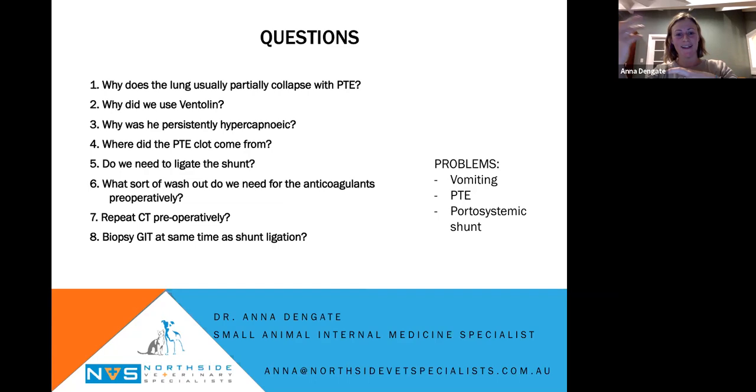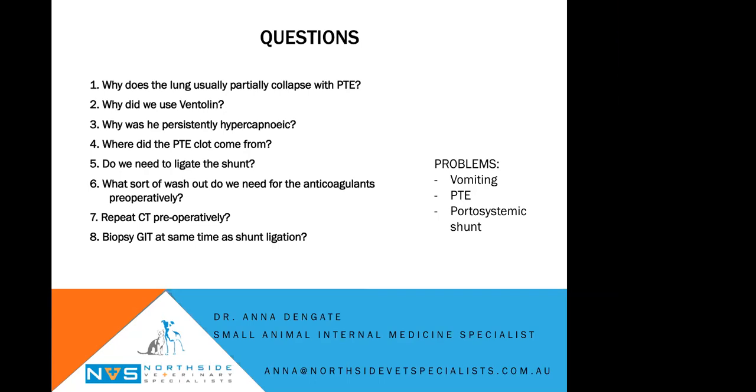Yeah, I mean, to be honest, in all of the shunt studies that I've looked at, even those ones up in the diaphragm, we just don't associate them with intravascular thrombosis. You know, it's just not. Yeah.